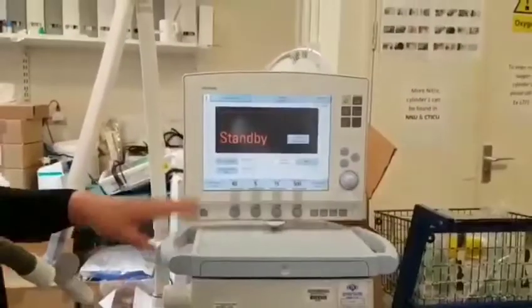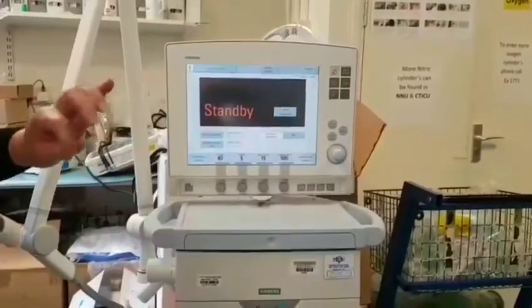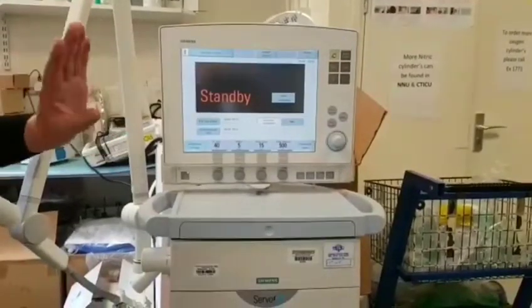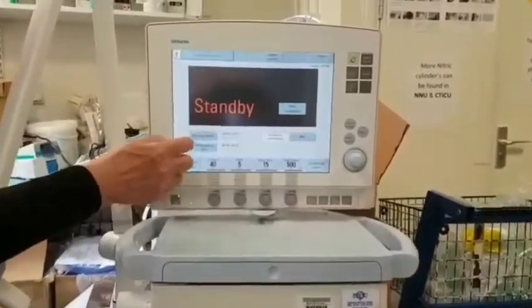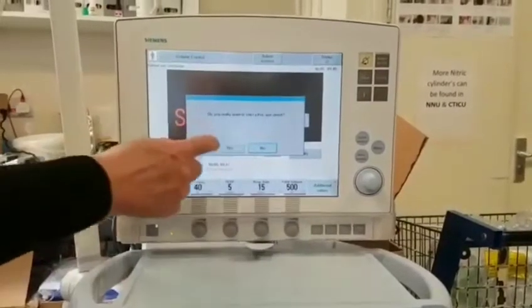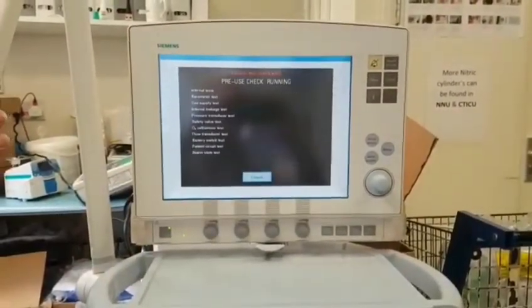I'm going to show you how to do a pre-use check on a ServoEye. 90% of the time the ServoEye will be in standby and you can just proceed to the pre-use check. Down here we have a pre-use check button. We press that and it says, do you want to start the pre-use check? Say yes, and it's just a matter of following the prompts on the screen.